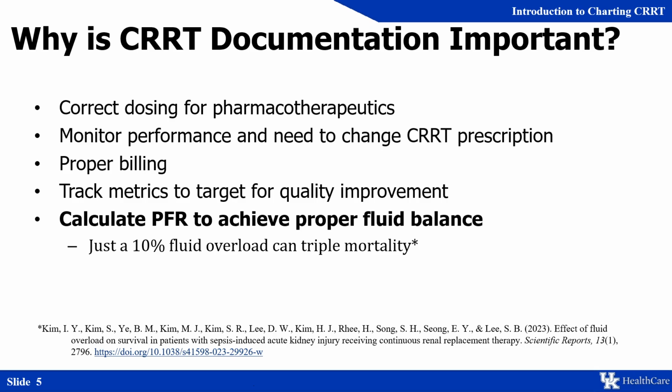It's going to help with proper billing, because in healthcare nothing is free. It's going to help us track metrics to target for quality improvement. If you can't measure it, you can't make it better. But most importantly for you as the nurse, it's going to help you calculate the proper patient fluid removal to achieve a proper patient fluid balance. Many patients who come into critical care are resuscitated with volume, only to have that same volume contribute to mortality later on. So CRRT is going to help reverse the tides on that.